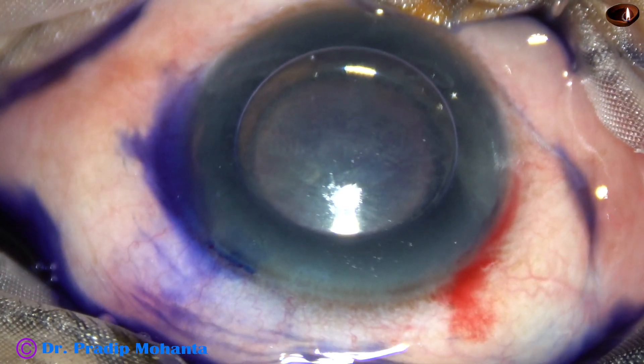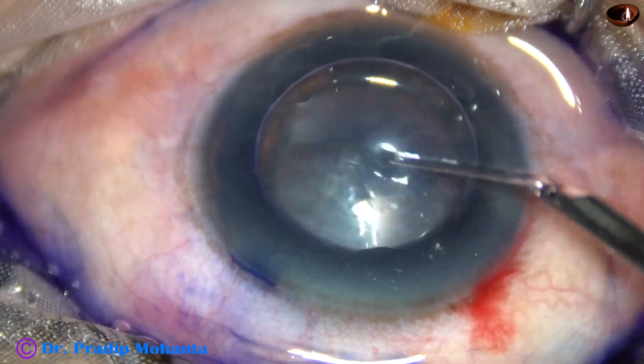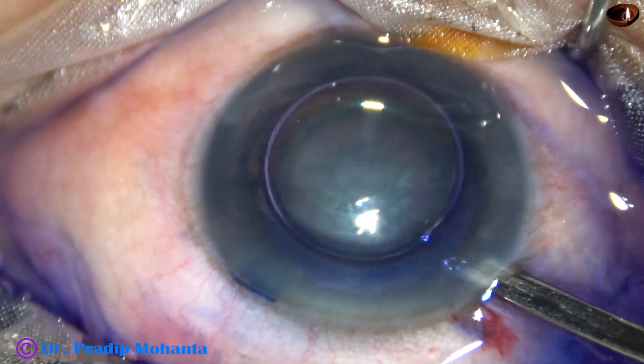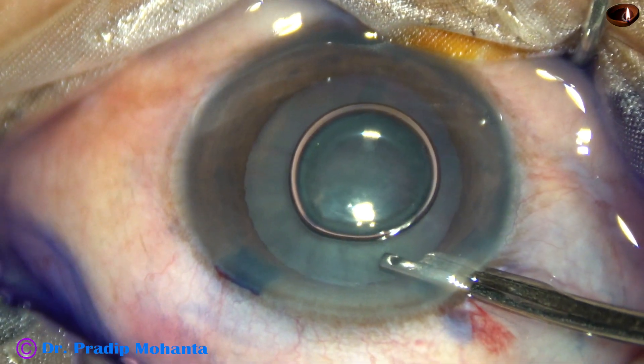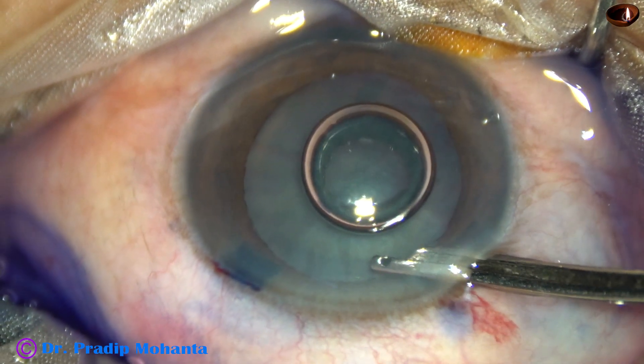The dye is then washed out with BSS for about 10 seconds.